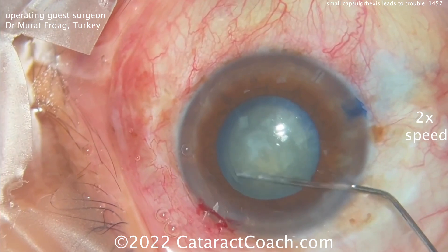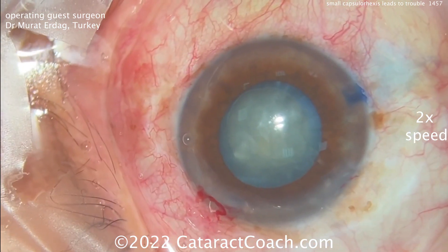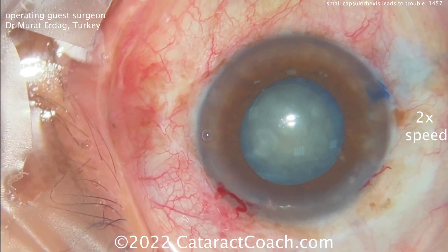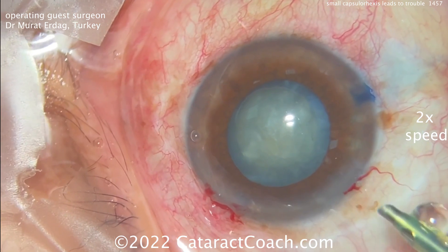I wanted to show this case to examine the reasons behind the complication we're going to encounter — primarily the small Rhexis — and also to demonstrate how to recover from it and finish the rest of the case.